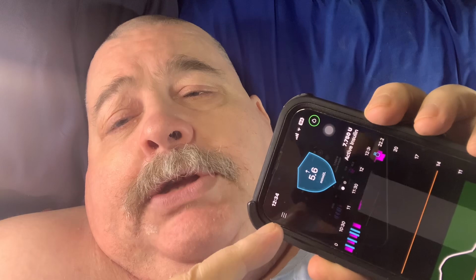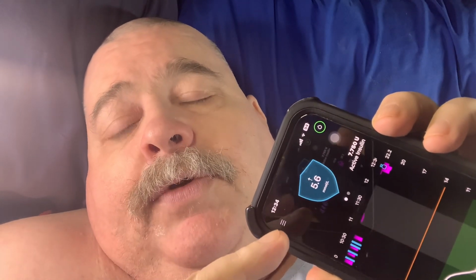Sorry, my mic went down. So, always make sure your equipment is up to date, clean. This, if I do a blood sugar now, would probably be out a bit further. But I find this is usually about 5 minutes away from where my glucose is. And what that means is the sensor picks up what your blood is doing. Your sugar is giving you a different story.